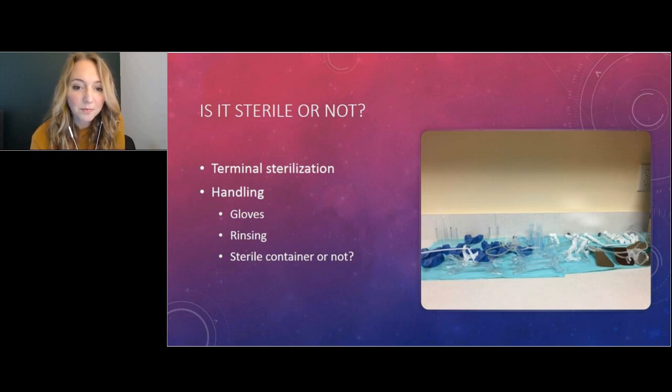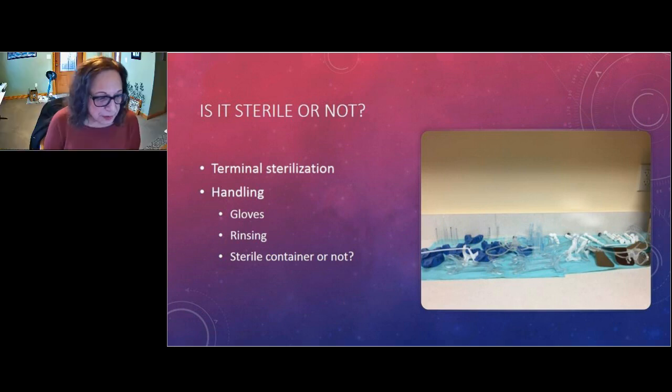You could try doing a direct comparison between your steam sterilization process and your soaking process, because I'm going to make a wild assumption here that you're taking your dental instruments that are going into the steam sterilizer and you're packaging them, right? So what's the rationale behind packaging them? Well, the outside of the package, once it's removed from the sterilizer, is no longer sterile, but the contents are sterile.